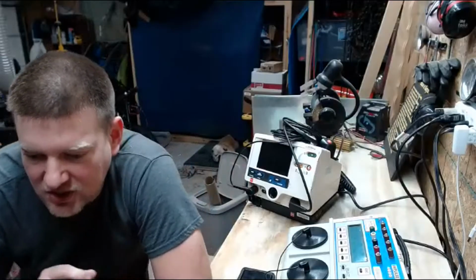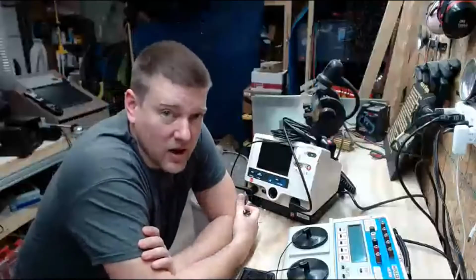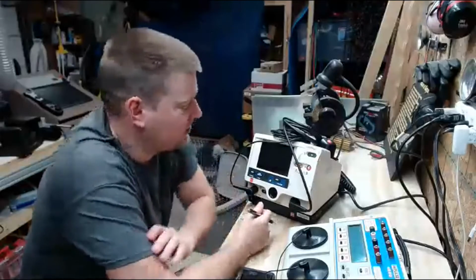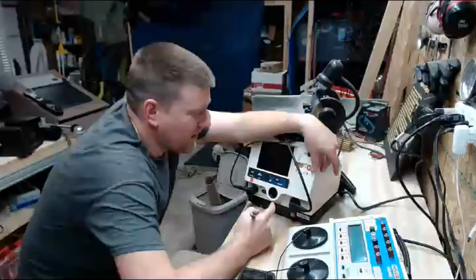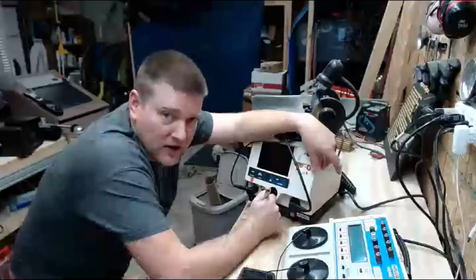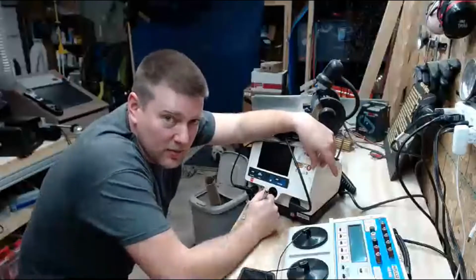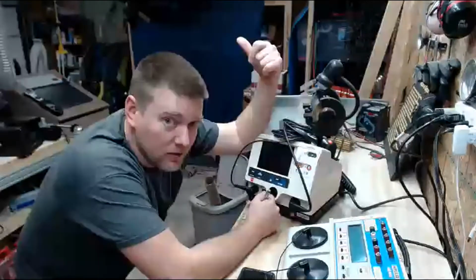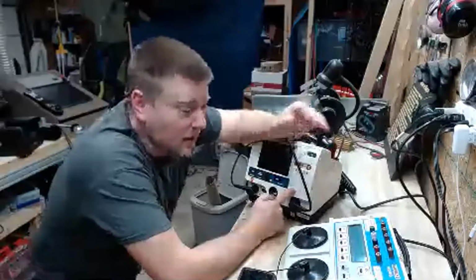Who should do the investigation, the biomed or the vendor? That's a good question, man. It's up to hospital management ultimately. You know, it's their ass. So the most important thing is if I was the last one to touch this defib, I should not be the person doing the investigation. Even if I'm the most senior biomed, that's one of those things where when in doubt, ship it out. Let them do the write-up.